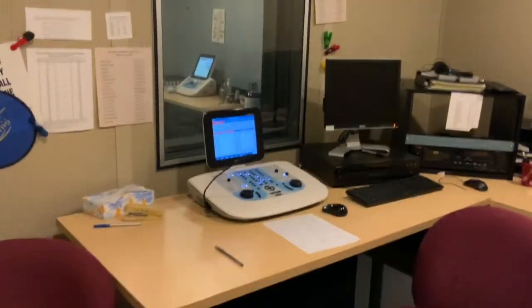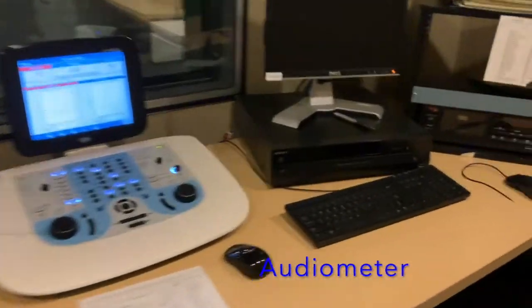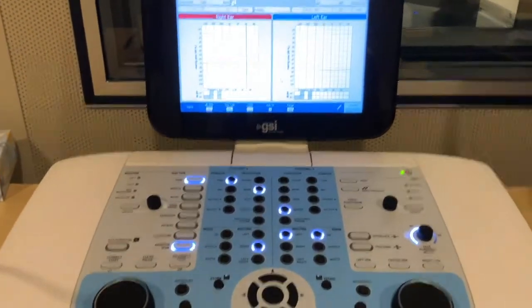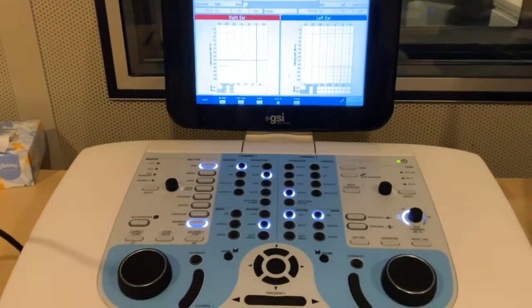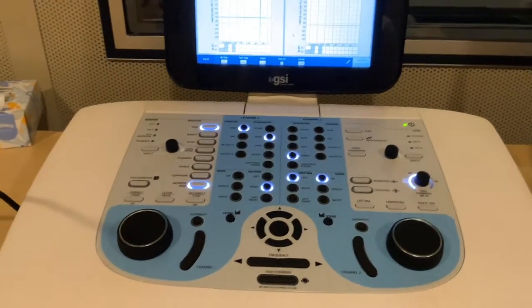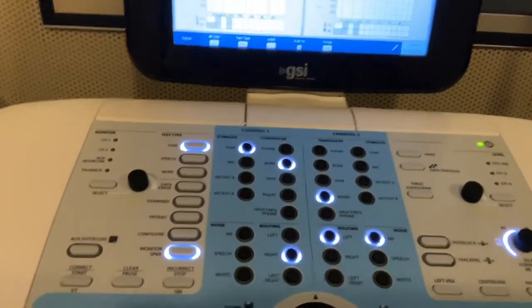Here we have our audiometer. You'll sit down and we'll see we have a number of controls. It looks pretty overwhelming, but since we're doing pure tone audiometry with insert earphones, here is what we're going to press to get it all set up.